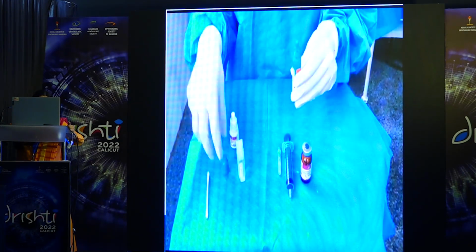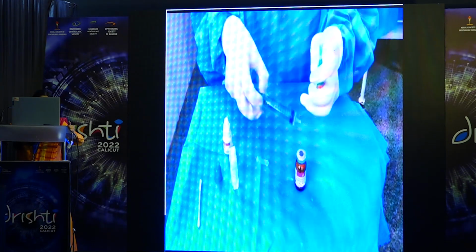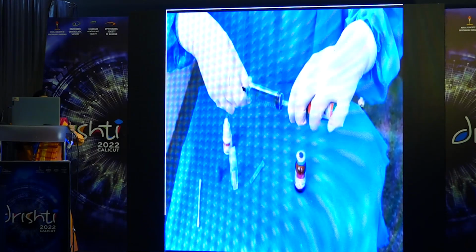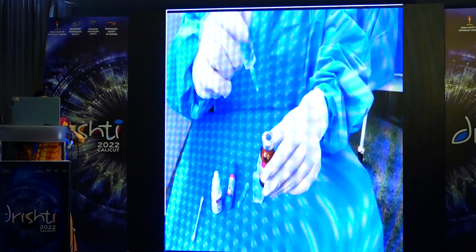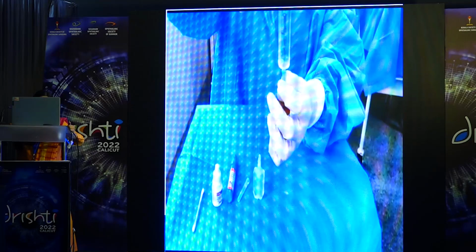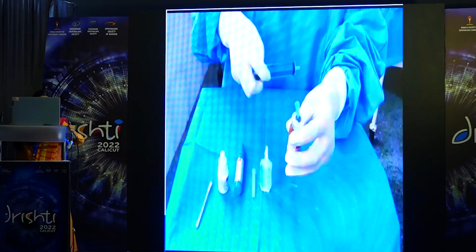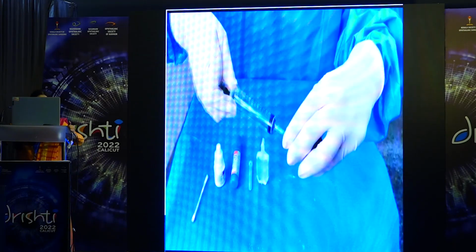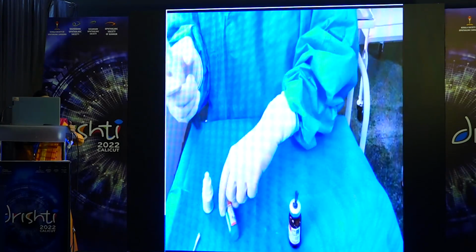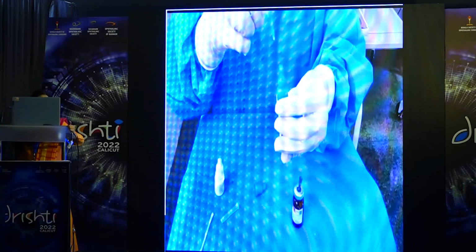Then, since she is preparing fortified vancomycin, she is taking the whole 10 ml of preservative-free artificial teardrops. Then the whole thing is injected into the vial. Then shake it well. Then take the whole 10 ml, and we can divide it into 1 ml and 9 ml. 1 ml can be added to the empty antibiotic bottle, labeled properly and given to the patient.